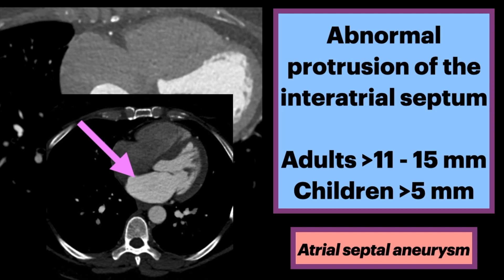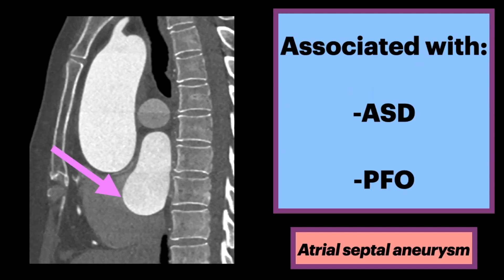Here's another example showing bulging of the interatrial septum into the right atrium. It is associated with ASDs and PFOs. An ASD, atrial septal defect, is a through-and-through communication in the interatrial septum that typically allows blood to go from the left to right chambers.